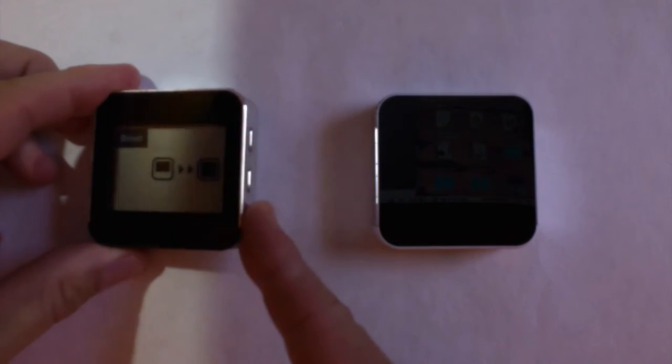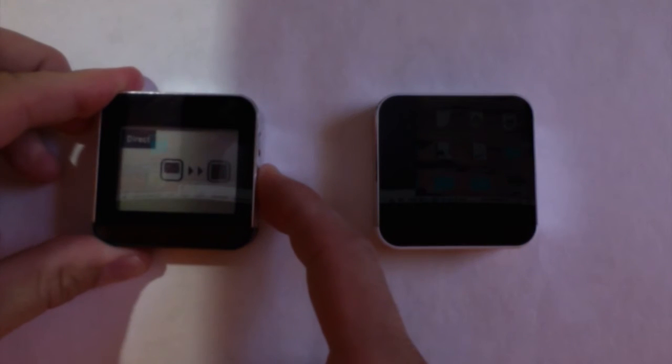The mini beamer transmitters are switches that send wireless signals, so you can send a beam across the room. They must be paired with each other first, so you need to press the mode button down until pairing is started. This switch is just like the gray switch because you can do latch, you can do it by time, or you can do direct selection.